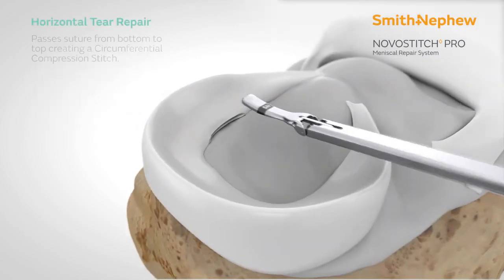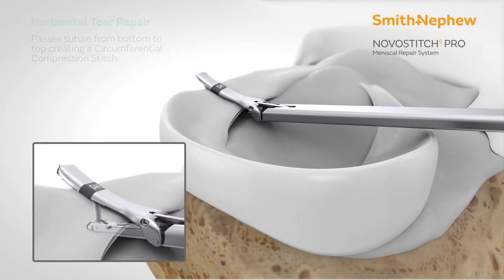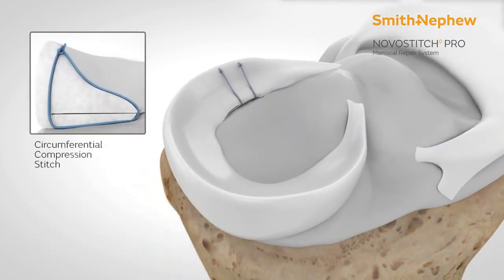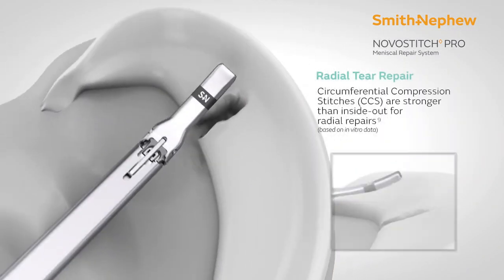What you need to do is pass the device onto the meniscus, push the lower joint side, push the trigger once, push the trigger twice, and then you can repair it nicely with the use of this device.